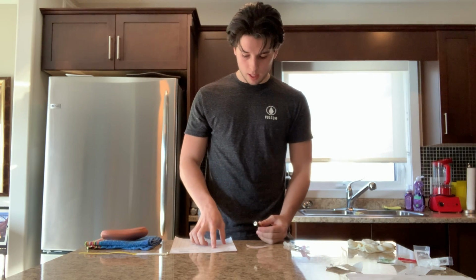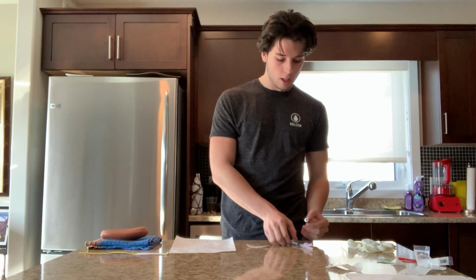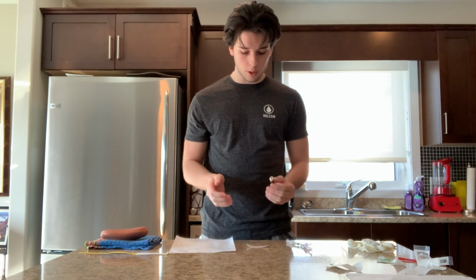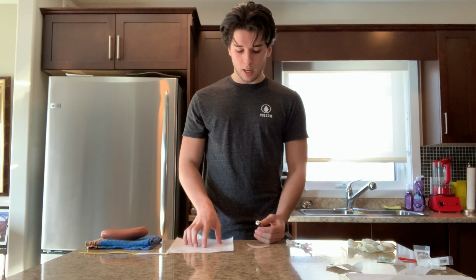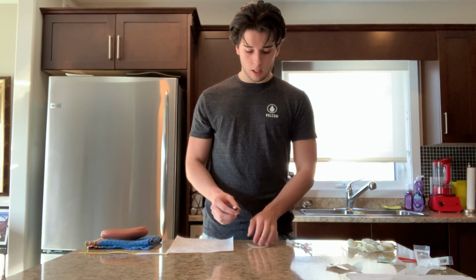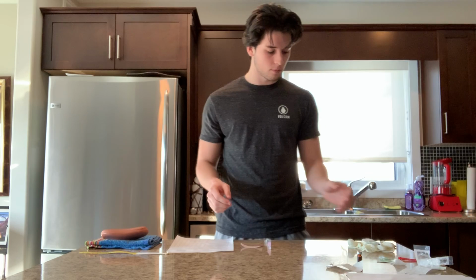So now that we have the dosage, we're going to look at the route. This is to be given subcutaneously, and we have our subcutaneous injection needle ready to go. On our vial, it says that it can be given IM and IV, but we did check the drug monograph, and it says that it is able to be given subcutaneously. And it is to be given daily at 0800. It's 0825 right now, so we're able to give this medication, and our second check is complete. So now we are going to get ready to go into the patient's room, so we can put away our medication vial and grab our supplies.